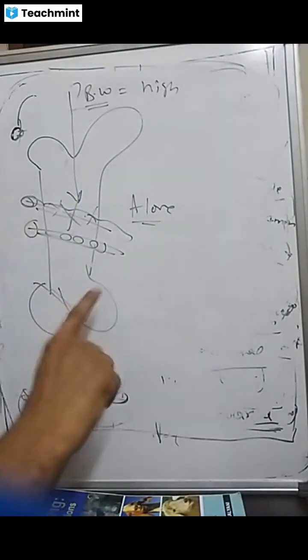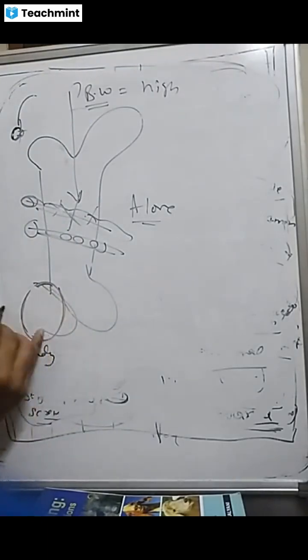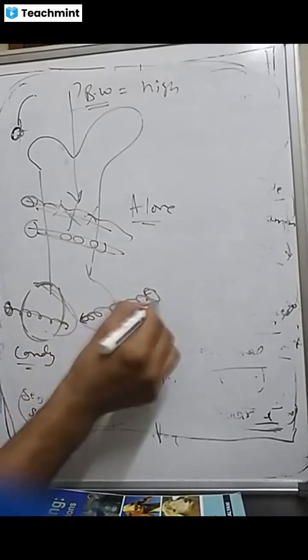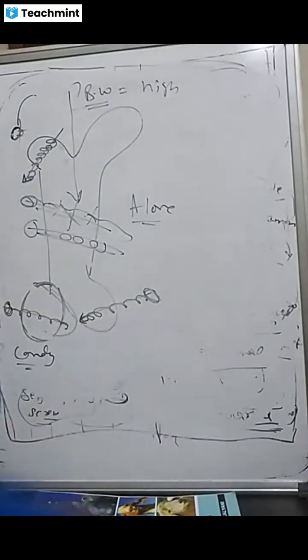The direct load of the body is not there at the sides, where we have the condyle or epicondyle. If they are fractured, apply your lag screws like this. Of the greater trochanter, you can apply. So at those places where load is not there, you can apply.